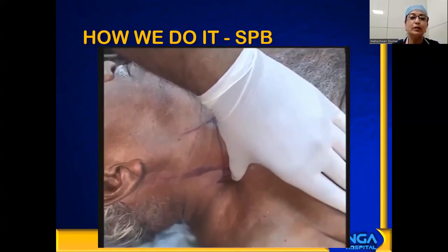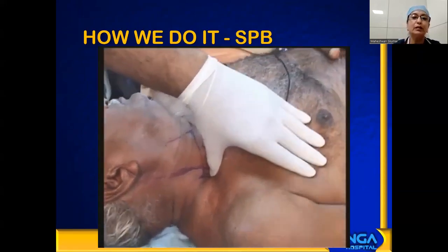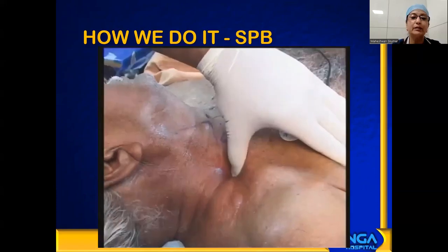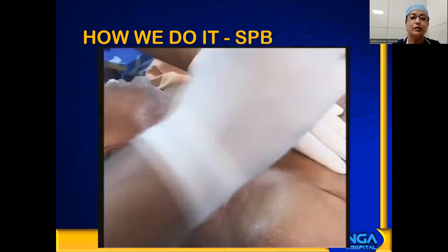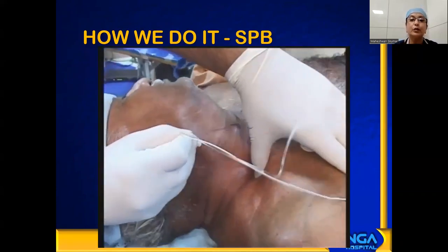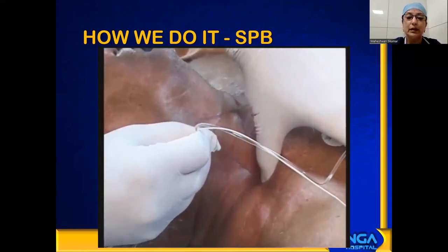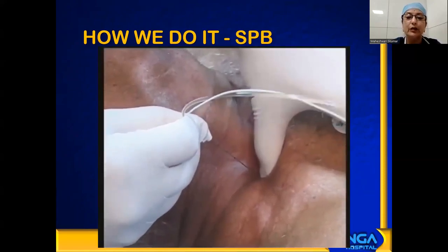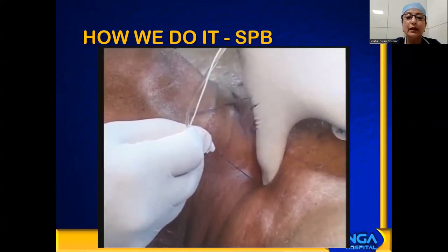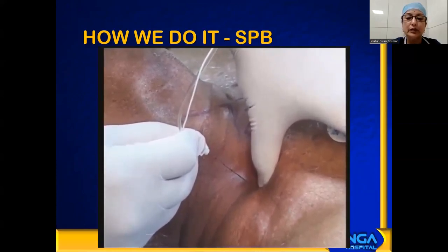So in this video, I will tell you how exactly we do the subclavian perivascular block. This is an 80-year-old man with chronic renal failure who came with a distal radius fracture. With the marker pen, we have marked the two ends of the sternocleidomastoid. And what I'm palpating, at the base of the interscalene groove, is the subclavian artery against the clavicle. So once you palpate and fix the subclavian artery, you take the needle, and the midpoint of your thumb has to be the point of entry, and imagine that the needle has to go posterolateral to the point of insertion of the artery.